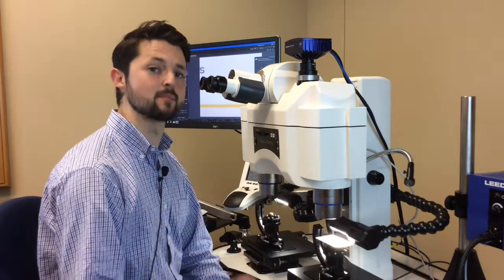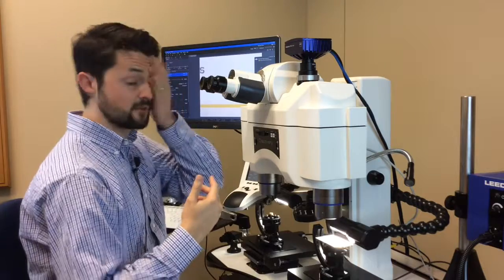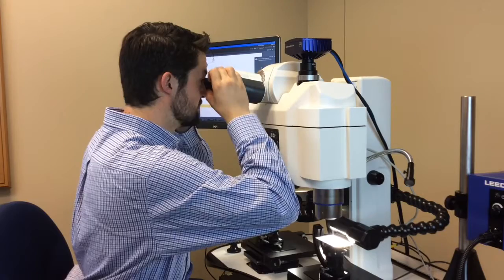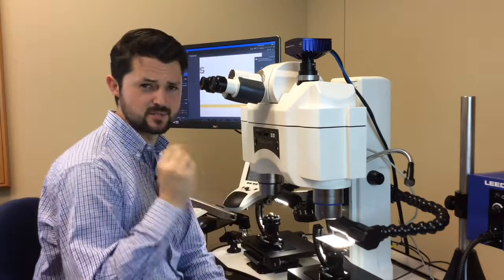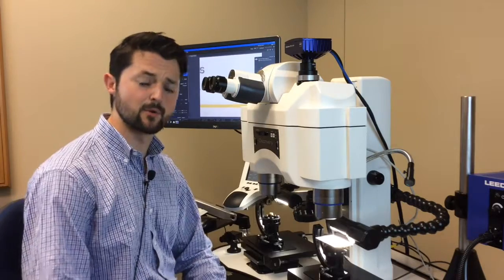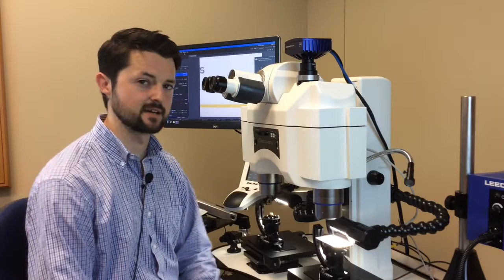Next, one eye at a time, I'm going to bring the image into focus at the eyepiece. You can do this either by covering one eye, or if you have to, you can close the opposite eye. The idea is to move quickly and confidently and stop just when the image gets in focus.